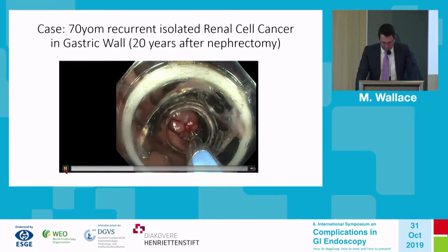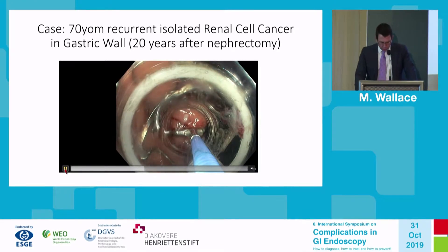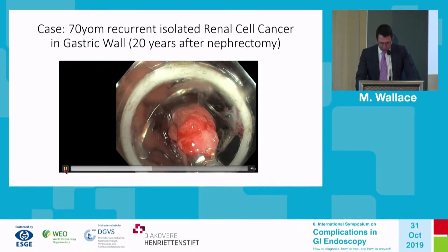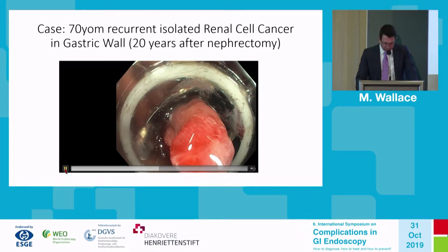You'll notice we're using a grasping device here. It's very important for safety and prevention of complications how we perform the retraction of the lesion into the scope. We generally do not use suction — we only use mechanical traction of this lesion, and you can see we pull the lesion.